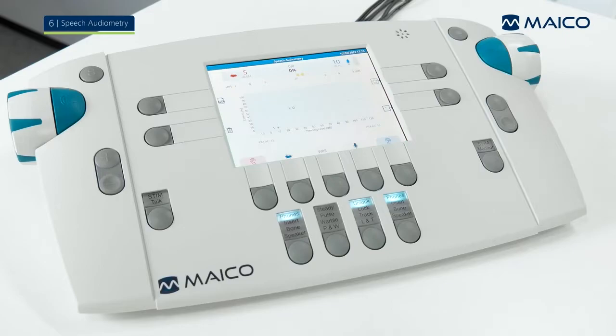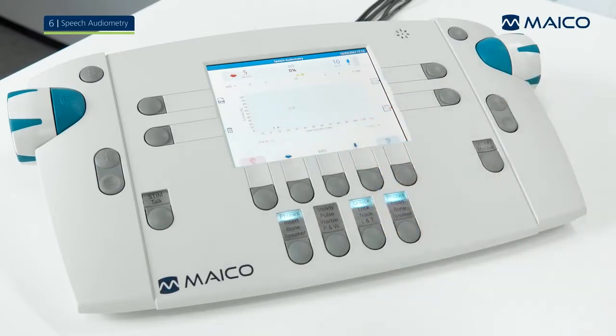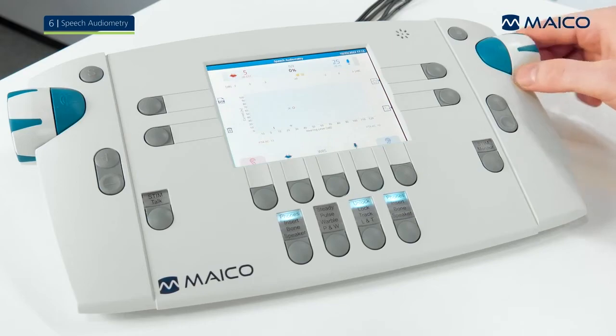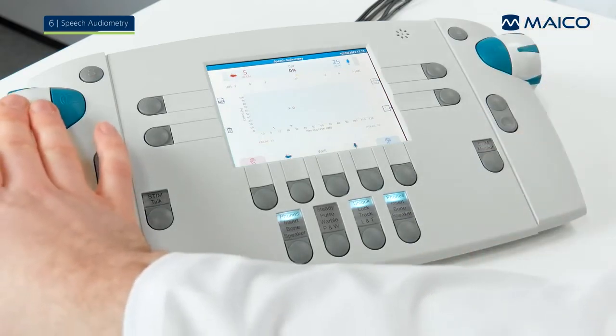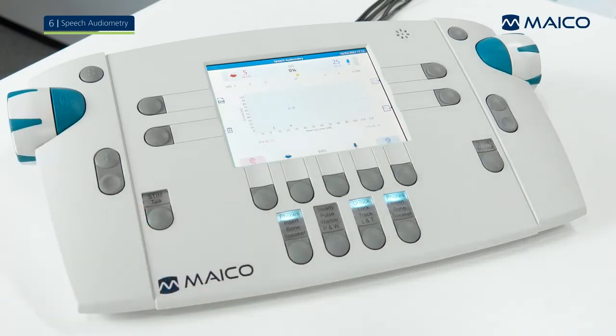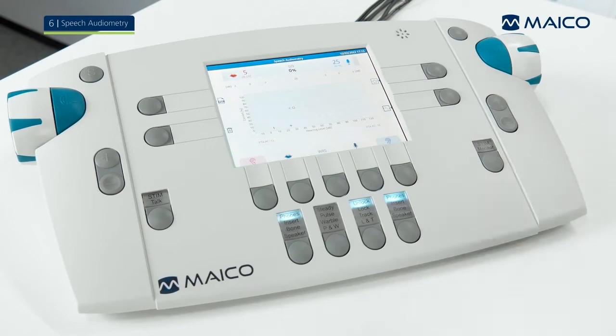The graphical display of the stored results appears in a speech diagram or table. Additionally, the cursors show the selected levels. The input signal is represented by a plus, the masking noise is indicated by a minus symbol. Below the diagram or table, the calculated PTA values are displayed.